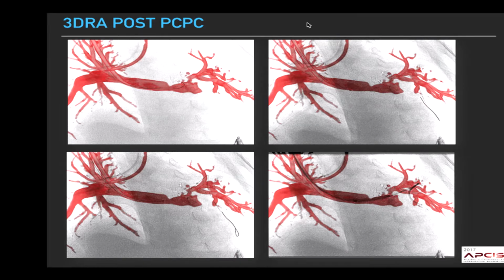So from rotational angiography we get more information, we use it to guide the intervention and to assess the final outcome. And in those patients after Glenn operation, in some cases we see that when we introduce stiff wires and then long sheaths, the misalignment sometimes is quite significant. Therefore, we also had to adjust our techniques.